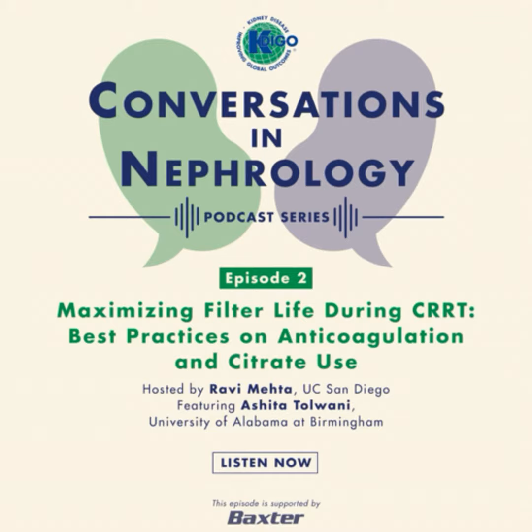That was very helpful. Given that regional citrate anticoagulation is now increasingly used and is being recommended as a preferred method for anticoagulation, is there adequate evidence to support this? There is. There have been multiple randomized trials now comparing regional citrate anticoagulation to heparin, and most of them have suggested that citrate provides increased filter patency.